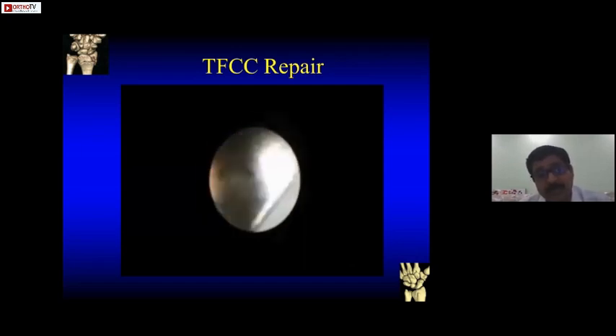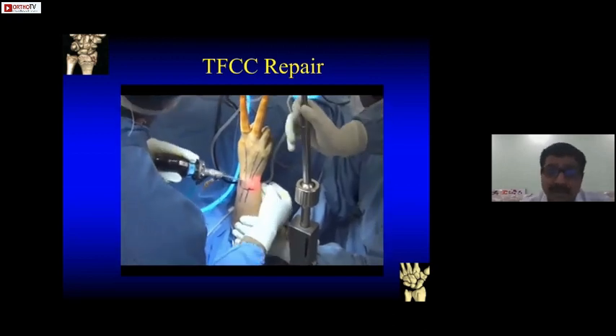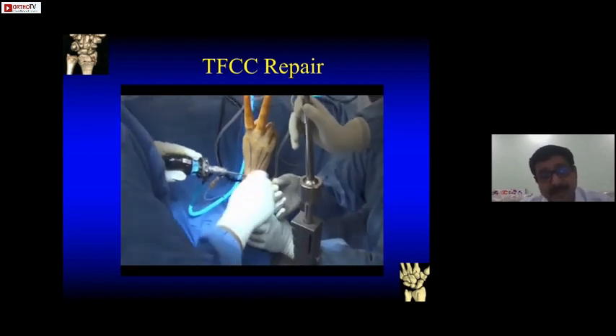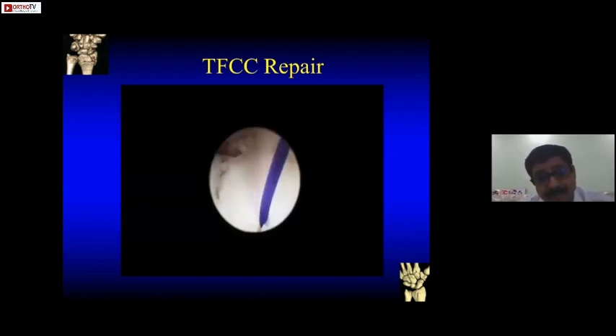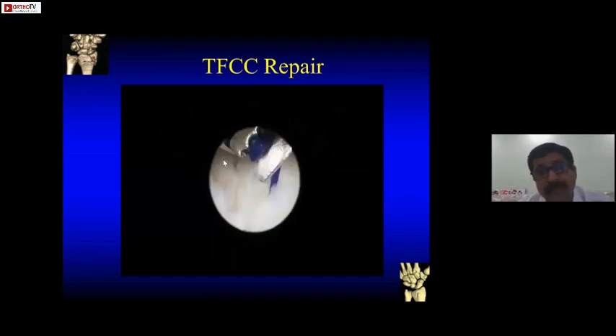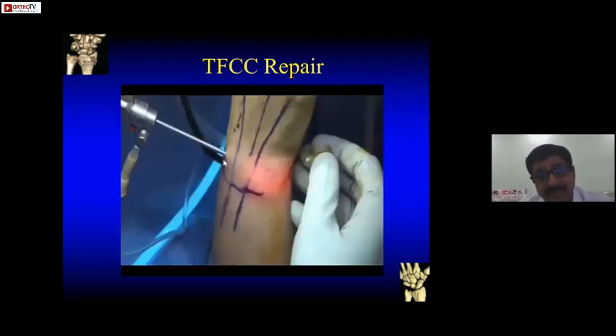Pass in your needle, and through the needle pass in your PDS suture. We use PDS sutures because they are absorbable — otherwise non-absorbable prolene usually impinges subcutaneously and gives trouble later on. Once you have passed the needle and suture through the 4-5 portal, retrieve the suture outside. Then pass another needle from the capsule, doing a capsuloplasty with a loop inside the needle. Retrieve the loop through the same portal, then pass the first PDS suture through the loop and retrieve it outside — this is how one interrupted suture is formed. Once you pull it, the edges approximate.